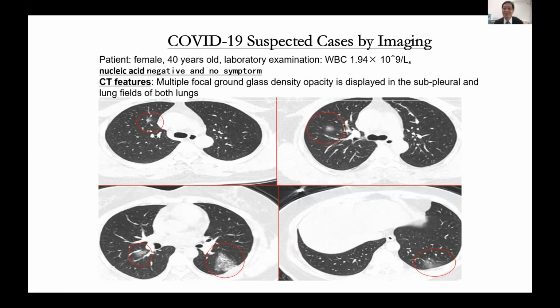COVID-19 suspected case by image. The patient is female, 40 years old. Laboratory examination, WBC. Nucleic acid negative and no symptoms.